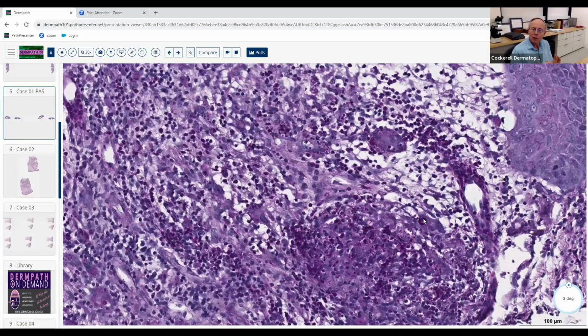If you're looking at chromoblastomycosis or those kinds of conditions, the organisms are pigmented and you can see them with H&E. We couldn't really see them here with H&E. We had to get the PAS stain, and it's positive here. It's as high a magnification as we can get here, but it's got this little darker outer shell, if you will. That's the cell wall, and then centrally it's got the cytoplasm here. So that's the actual blastomycosis spore, if you will, in tissue. And here, if you look carefully, you see it's actually budding.